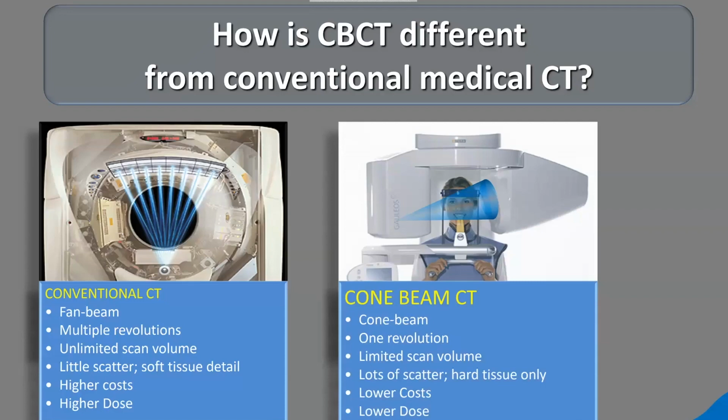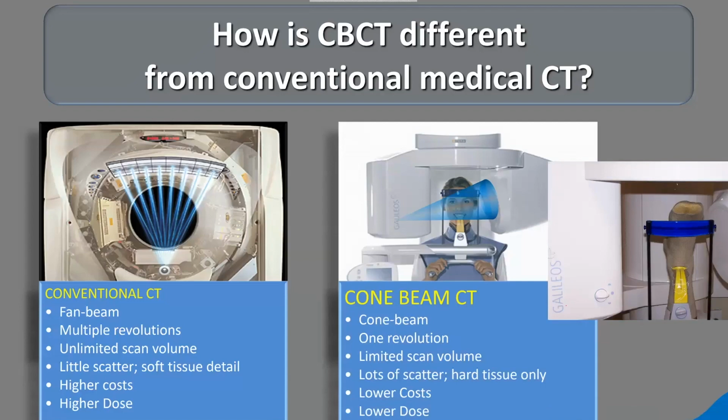Now, this does one revolution. We say it has a limited scan volume. It is supposed to just be for your head. But we do see dentists sticking their hands or their feet in it, or anything they think they've broken. In fact, sometimes they'll send them into our private practice and say, hey, did I break my foot skiing over the weekend? Well, as a dentist, I'm right there with you. I'll probably stick anything in that machine I think I've broken. As a radiologist, I have to give my legal caveat. Please don't try this at home. It is supposed to just be for your head. Now, this does come at a lower cost as well as a lower dose to the patient.